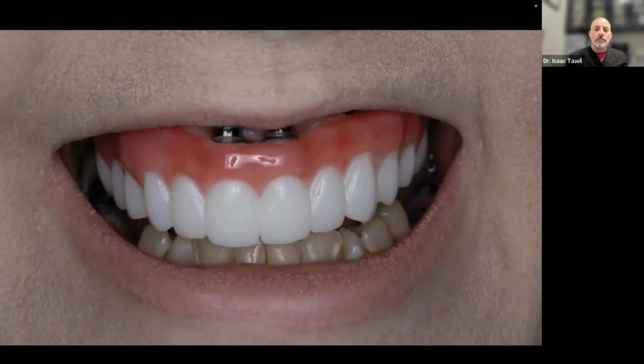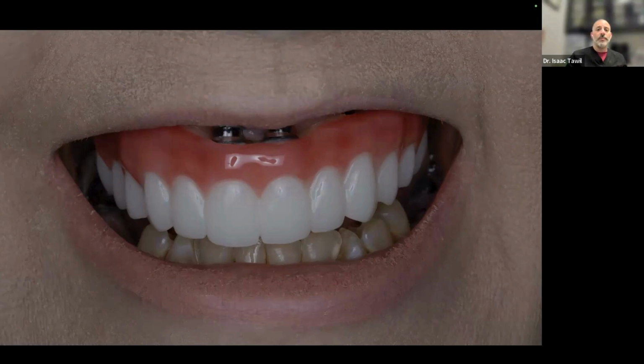So what happens when we don't have the right records is we end up with situations like this. Here we have multi-units that weren't planned correctly. The transition zone wasn't planned correctly. And so now we're seeing the metal from the multi-unit. When we ask the patient to smile a little bit heavier, the Duchenne smile, all of a sudden we can see that metal, which is not going to be helping anybody in the case. The patient will be covering their mouth instead of smiling brightly, or they will send the case back to you to say, hey, can you add more acrylic? Can you add more porcelain? Can you add more ceramic filler to block out the metal, which leaves us in a very poor hygienic situation?